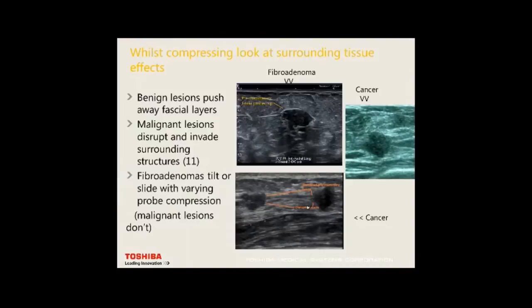While compressing, look at surrounding tissue effects. Benign lesions will push away the fascial layers — like the premammary fascia or ducts. Malignant lesions will disrupt through the layers. Here with a lady with multiple breast cancers, we can see the premammary fascia and breast ducts — the cancer is eating through the premammary fascia.